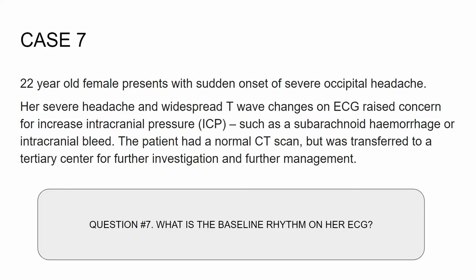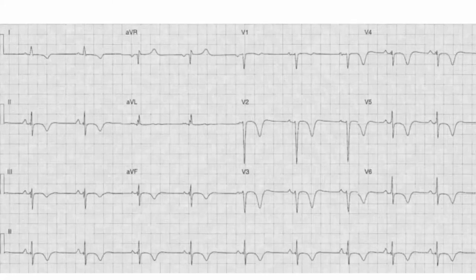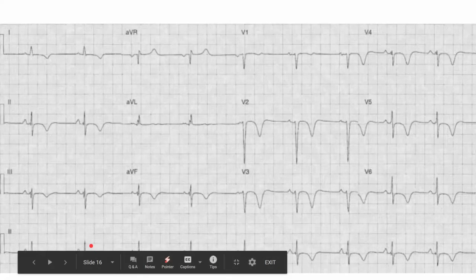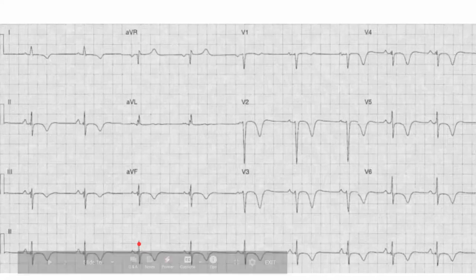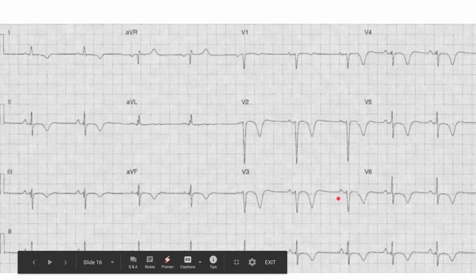A 22-year-old comes in with some problems. Let's look at the EKG. Is it regular or irregular? It's pretty regular. How fast is it going? Let's count: 300, 150, 100, 75, 60, 50 — it's going maybe 52, 53, 54, something like that. This is an example of sinus bradycardia. It's got P waves, it's got QRSs and Ts. Sinus bradycardia.